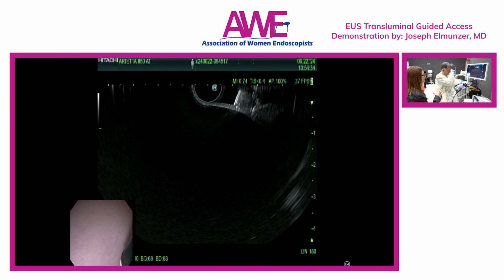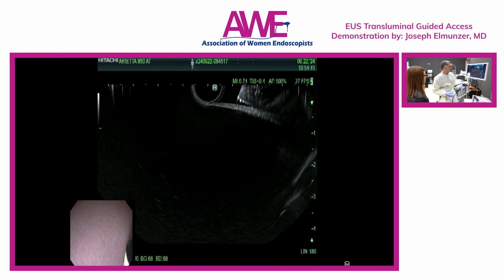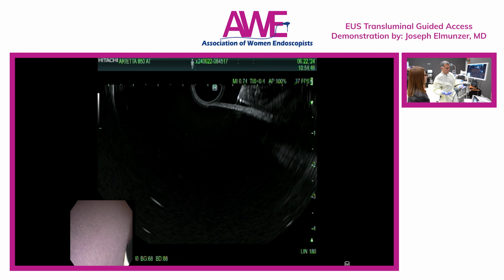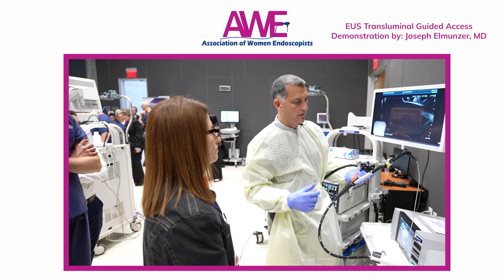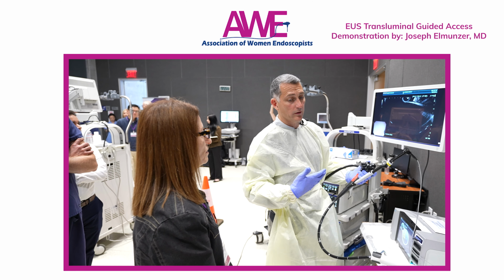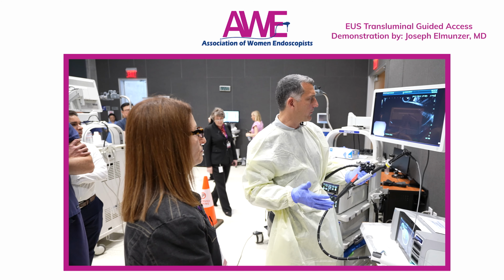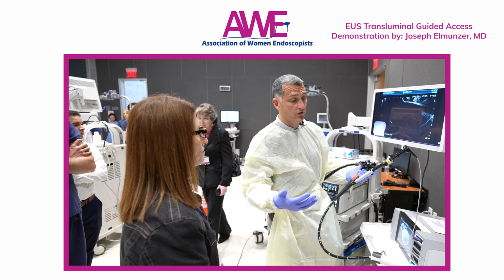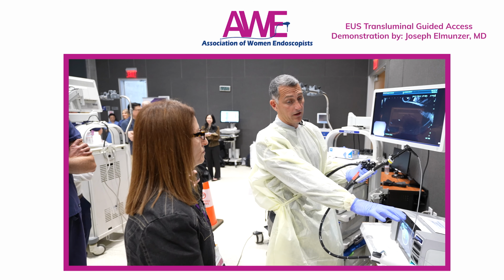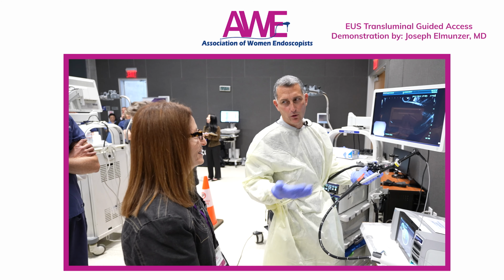Joe, is there any distance that would concern you if it was too thick or too thin, that would be a difficult challenge when you get into the orifice? Well, in principle, if the wall that you are traversing is terribly long, there's a chance you will deploy the proximal, the closer flange, into the wall and then get a maldeployment. So you have to be somewhat thoughtful. Part of the concept of the lumen-apposing metal stent is that when you deploy the far flange and pull back, it should bring everything toward you and shorten that distance, but that doesn't always work out perfectly.